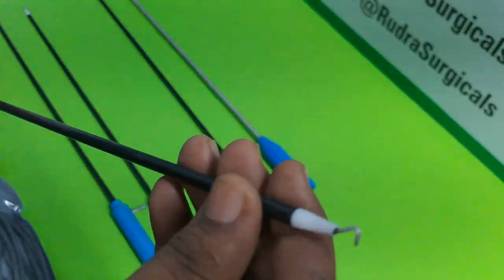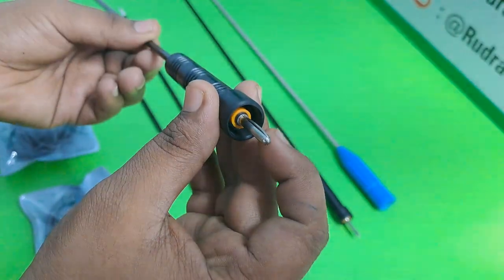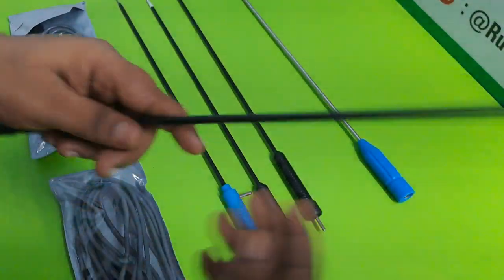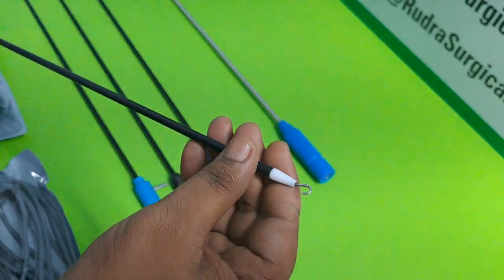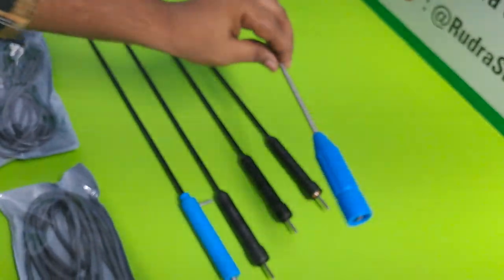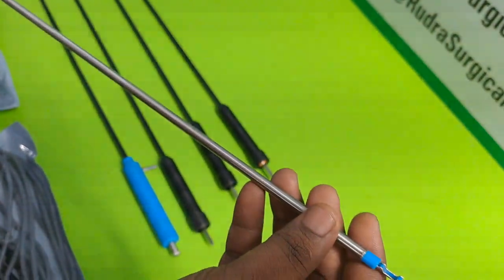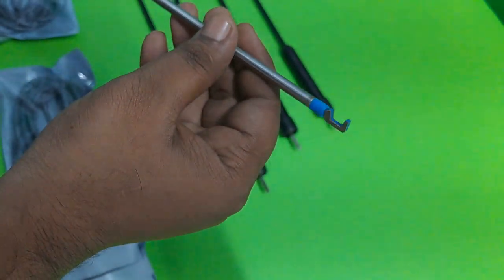And this is the L-hook. And this one is the Monopolar Pin. And this one is the J-hook. This is the Bipolar Electrode L-hook.